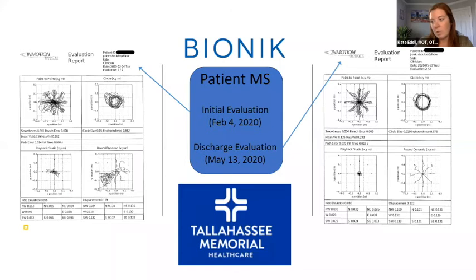Our next question is, if you can describe a patient scenario that shows how the InMotion reporting system has impacted your treatment and that patient's progress. So tell us about this person. So this patient, his name is Michael.